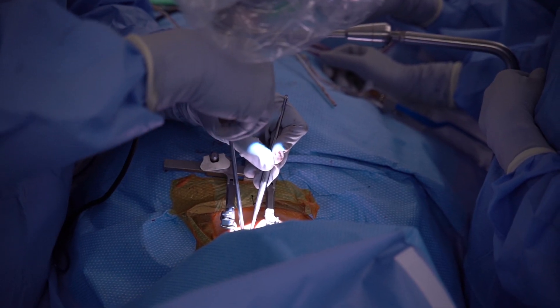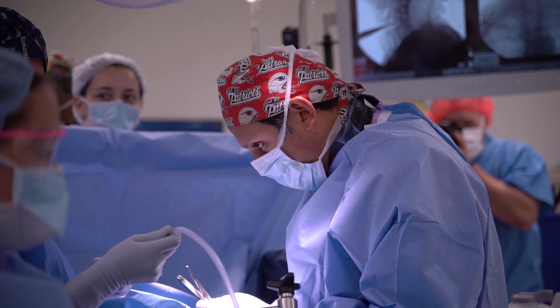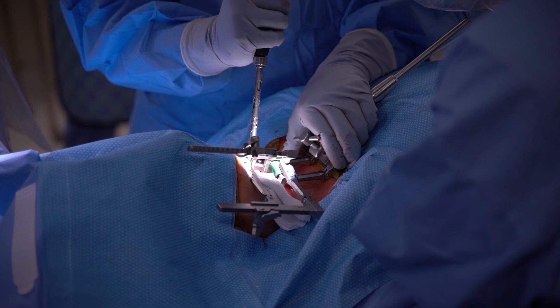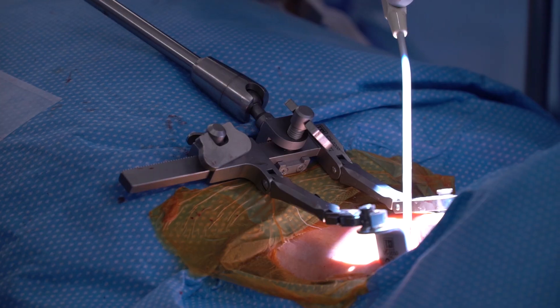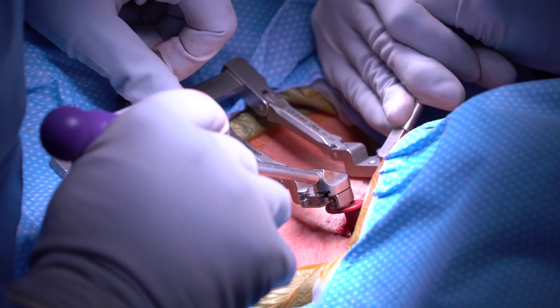Initially we used any retractor system that basically had an attachment, would retract, and then we found later on that it would come loose, that the blades would rotate, that they wouldn't maintain their position or their access. Now I have very specific preferences as to which type of retractors I use. Also, if you're trying to do multiple cases in a day and move efficiently, and keep the patient under anesthesia for the least amount of time possible, you want to make sure that maintains. I have specific preferences that the retractor maintains its position, opens a certain way, and allows you to maintain the same access without having to open up too wide and place more pressure on the esophagus.